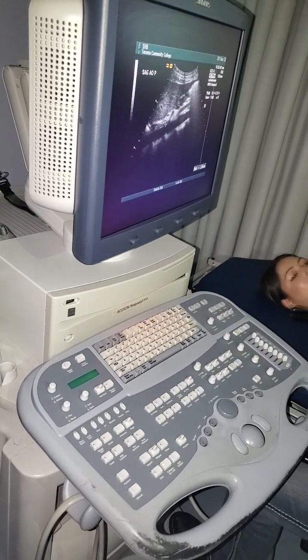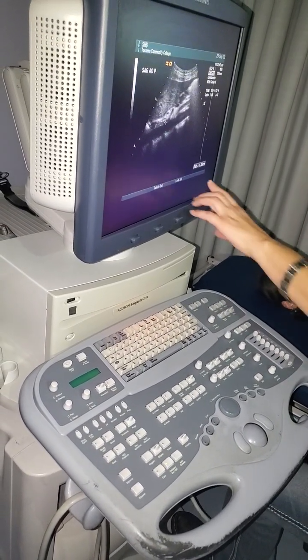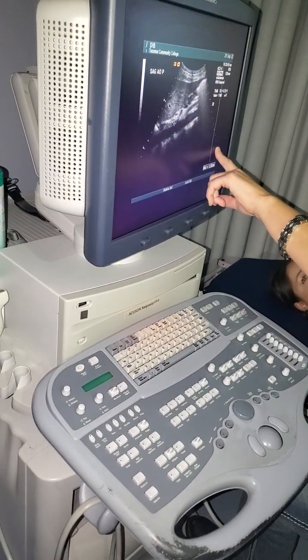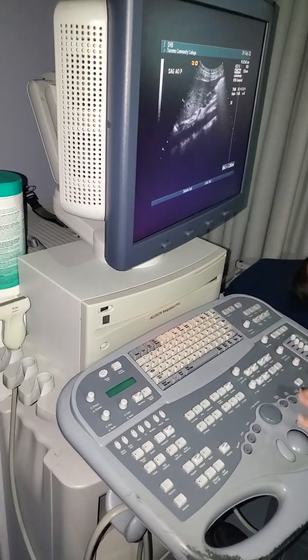Is it on the screen, 120 millimeters? Oh, over here. Yeah, distance. So 120 millimeters is, I think, all the way in. Yeah. But yeah, this is just this.